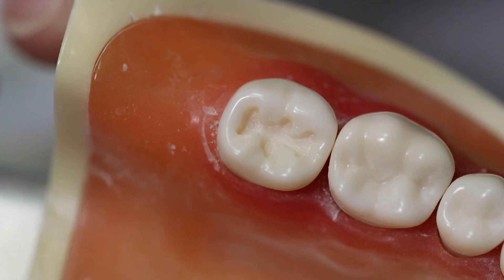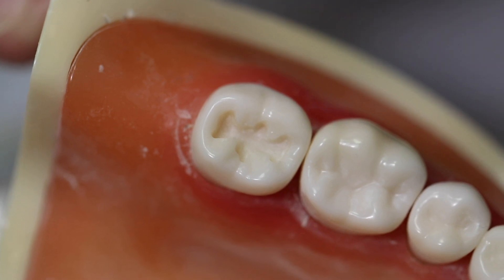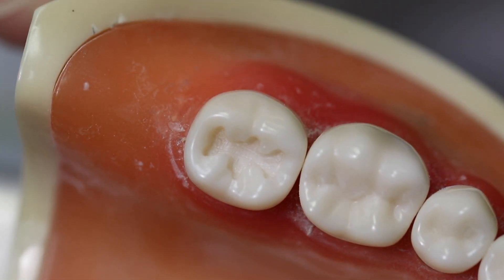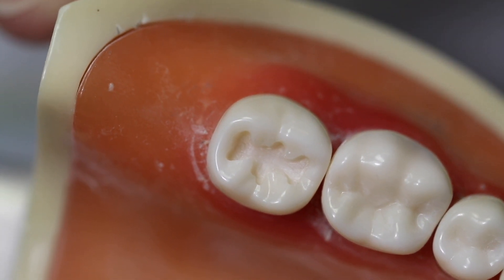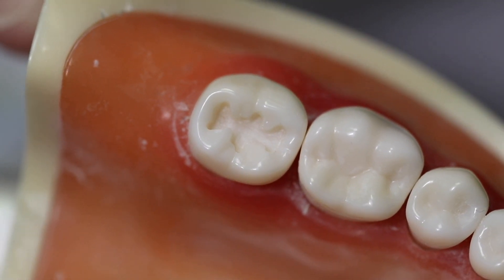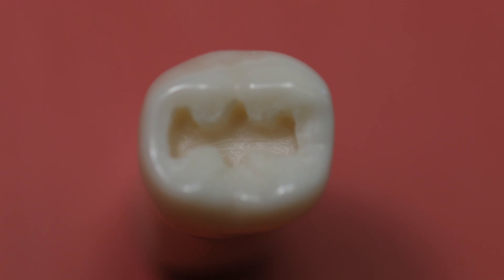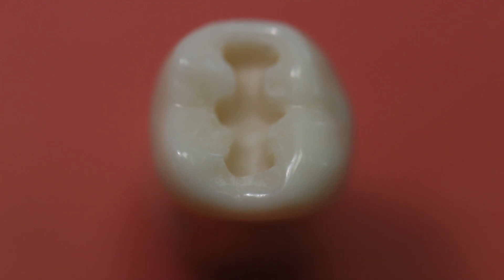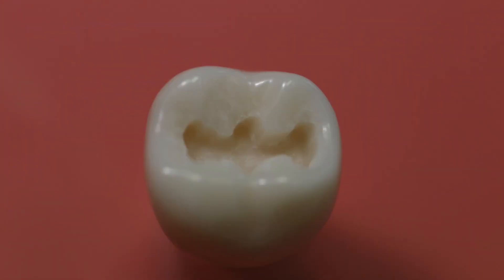The width of the prepared tooth should allow convenience in placing the restorative material. The walls should flow and be smooth, and the floor should also be smooth. When evaluating your final preparation, the floor should be uniform and smooth and the walls should be smooth and flowing.